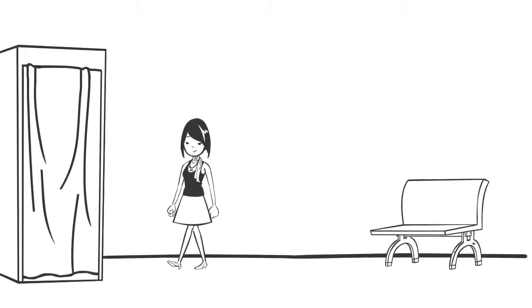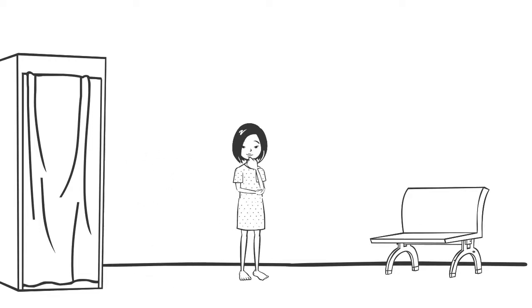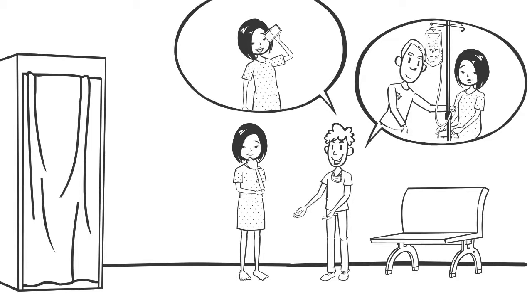When you arrive, you may be asked to change into a patient gown. This is because metal items such as zips show up on CTs and could cover up what we're trying to see. Some CT scans require preparation, so you will be asked to attend the hospital in advance of having your CT. You may be asked to drink water or have a needle put in your arm to allow a liquid to be injected during the scan.